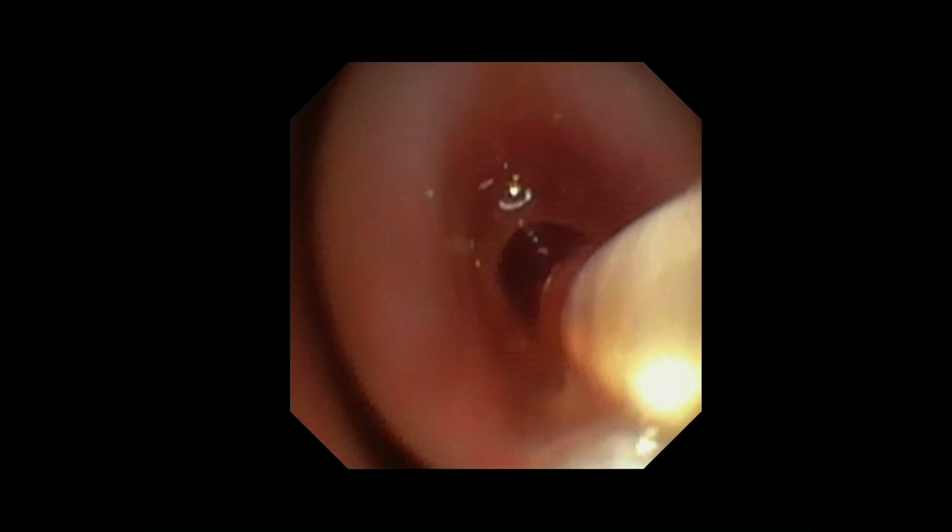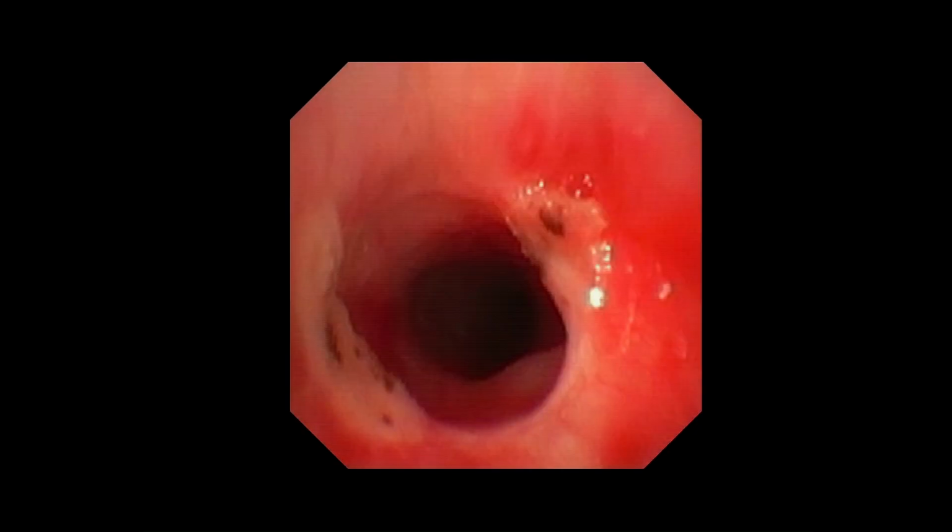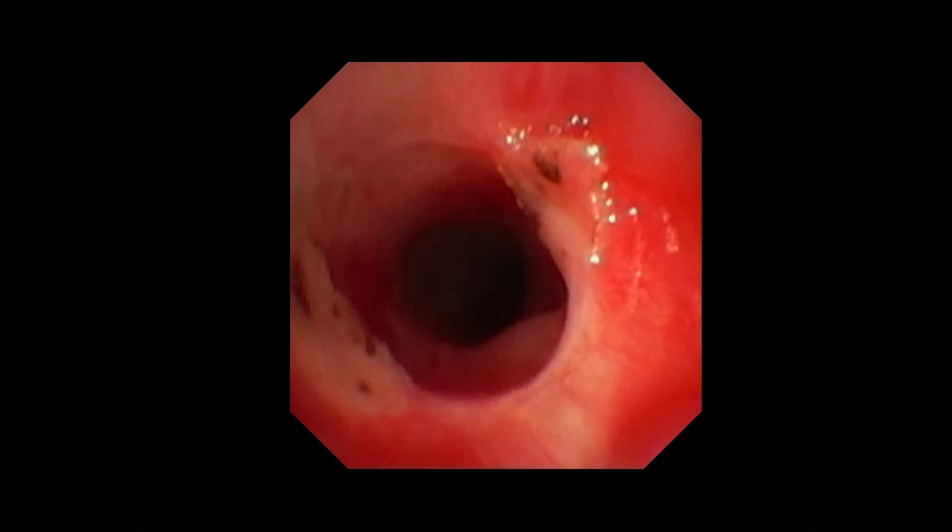Following electrocautery cuts, we use a small balloon to dilate the stenosis. And then with the balloon, you can see the luminal patency is achieved. You can do it many ways, like you can use a laser to achieve the result here, but here we use a small electrocautery knife, high frequency knife.